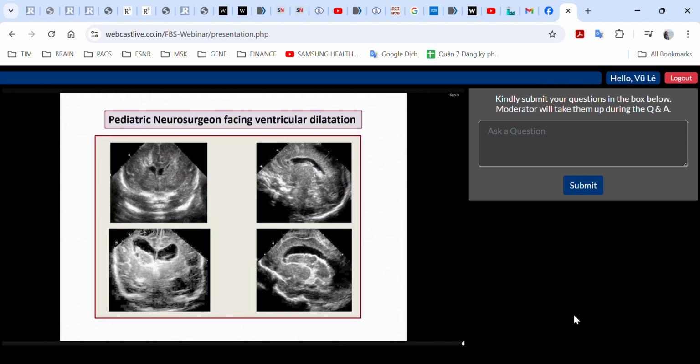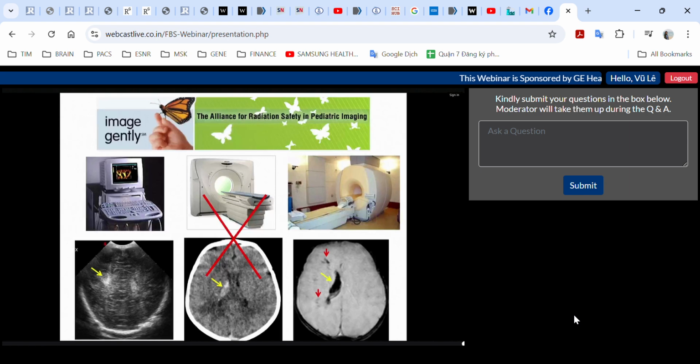The extent of ventricular dilatation may be different, and we can assess this using ultrasound and MRI, which allows us to avoid the administration of ionizing radiation on newborns. Brain MRI is the gold standard for the evaluation of brain injuries associated with prematurity. In addition, MRI makes it possible to measure in a simple, reproducible, and reliable way the various brain structures, which correlate with the most sophisticated techniques of cerebral volumetry.